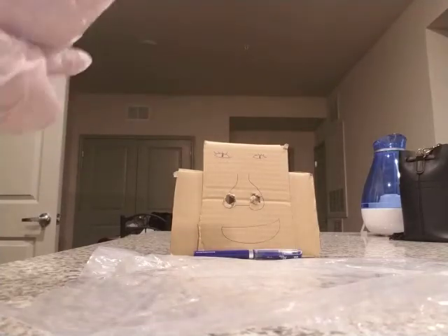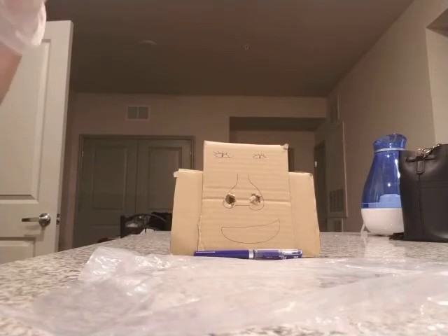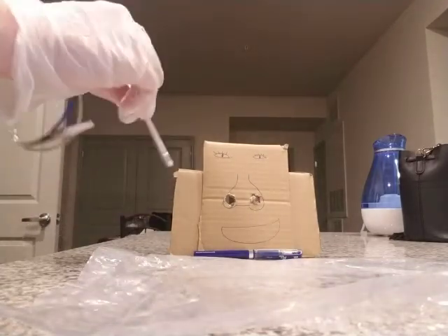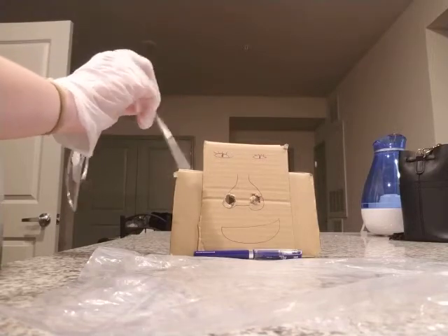So the first thing I'm going to do is measure the estimated length of the tube. We're going to measure from the tip of the, artist's interpretation here, right? So we don't have all of the correct anatomical parts, but we got the important ones.